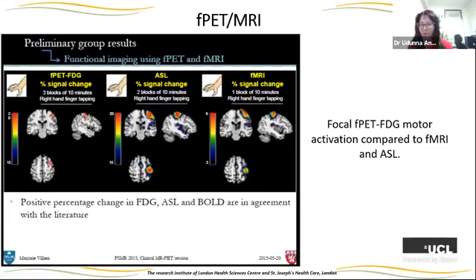Yeah, so you don't really need focal measurements for that, because you have to remember that the feeding vessels go up into the brain and go through the vascular territories. One issue with doing ASL, if you do one labeled measurement where you use one bolus to read out your whole brain signal, is you might end up having the problem you're describing, where you get into the deep brain and you might have transit time issues.